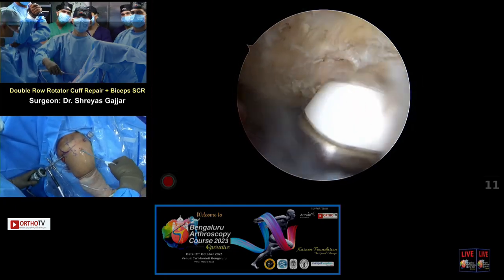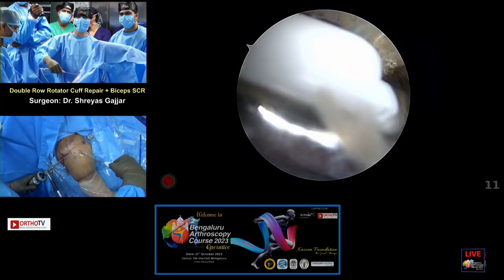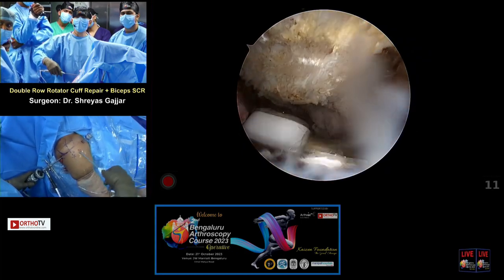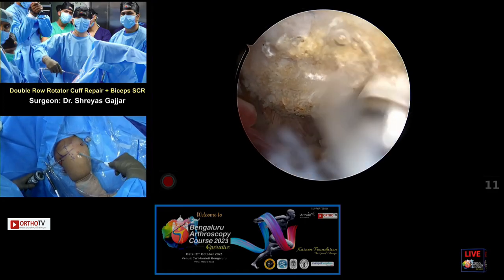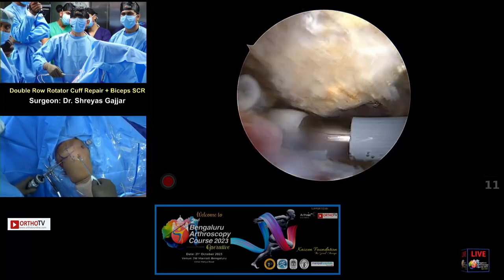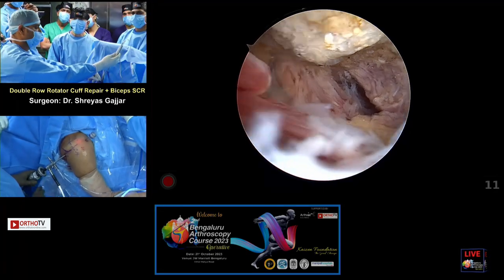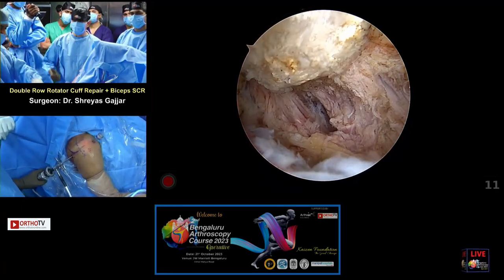And the CA ligament, unless it's massive tears, I release the CA ligament both anteriorly and laterally, as you can see here, until the deltoid fibers are seen. So now I'll just use the burr to do a very thin acromioplasty.